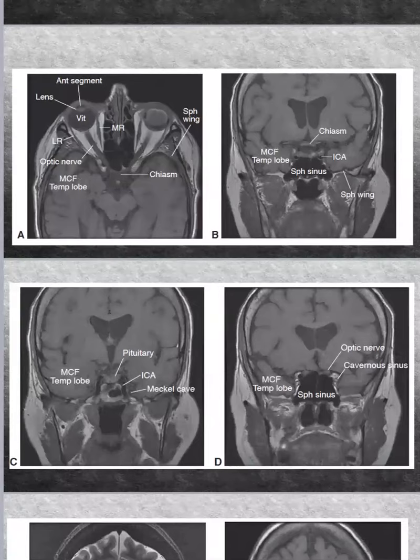These are examples of normal MRI. Here, this is the anteroposterior view. As you see, this is anterior and this is posterior. And to look at this, by the way, this vitreous may have vitreous hemorrhage or vitreous lesion, but this is not.